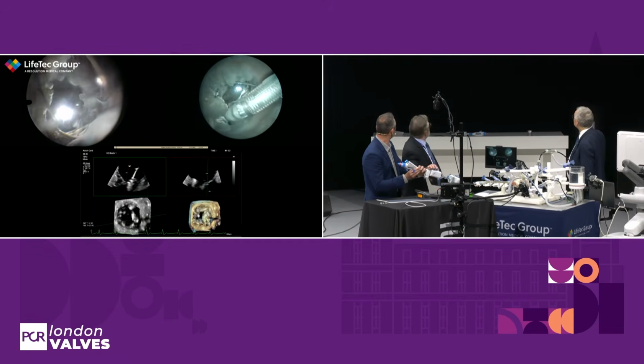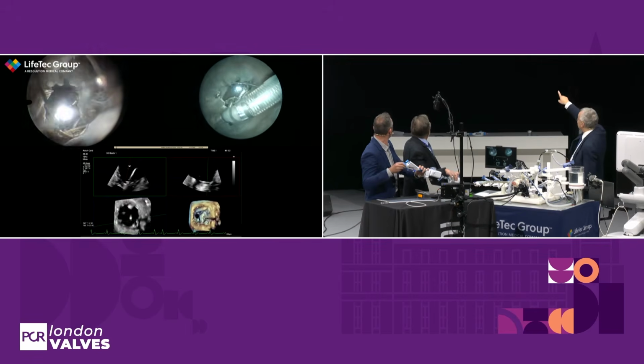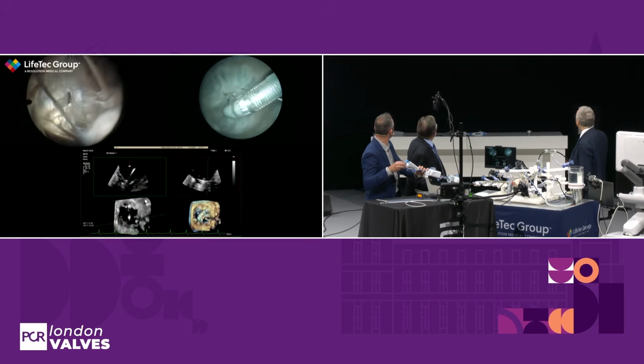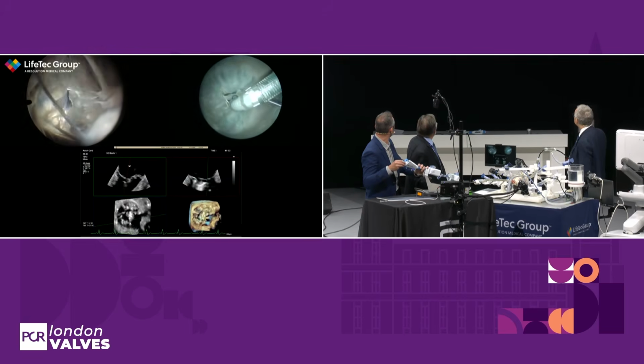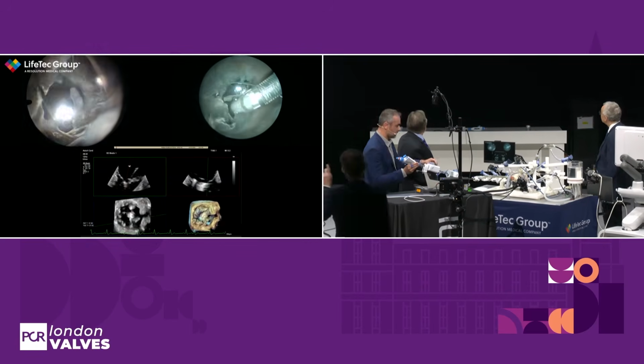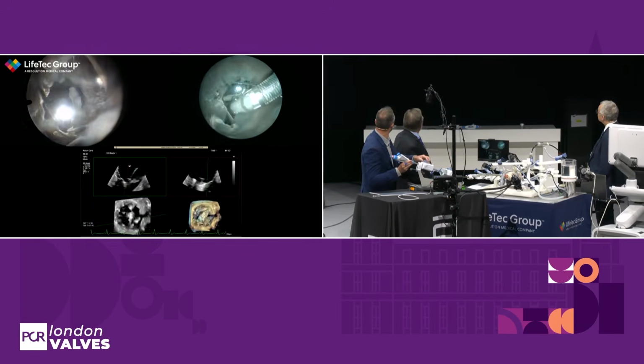But you are a bit not really in the coaxial zone. You see on MPR you are not there. Also on the image you are not there. Okay, and let's unflex a little bit.